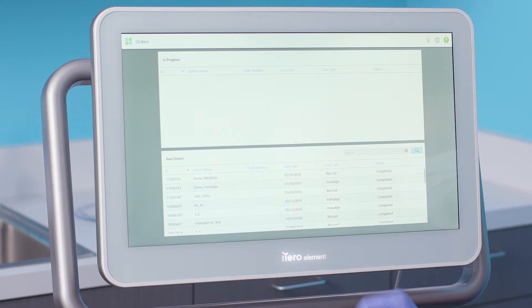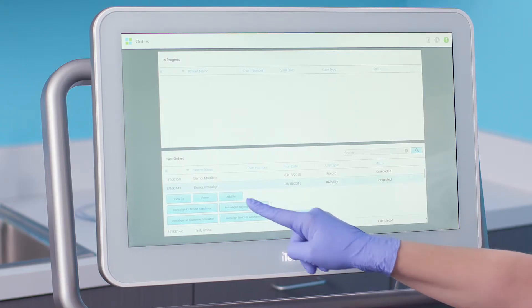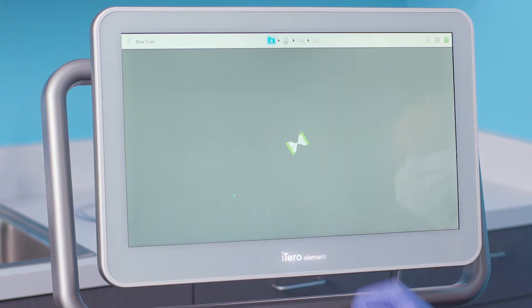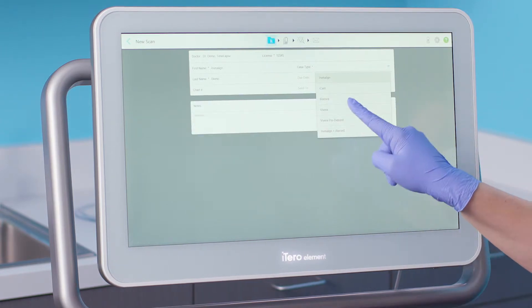Next, I will choose the patient from the patient list and select Add Rx. Then I will choose the new case type.